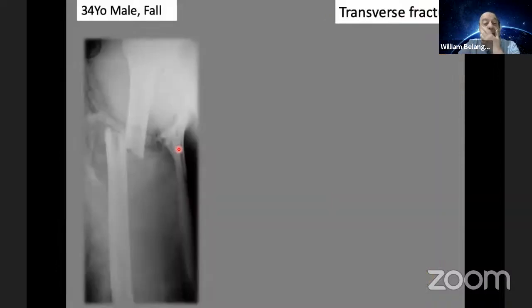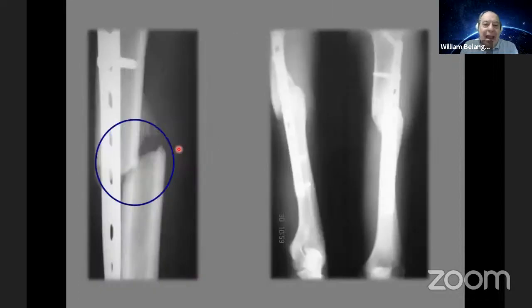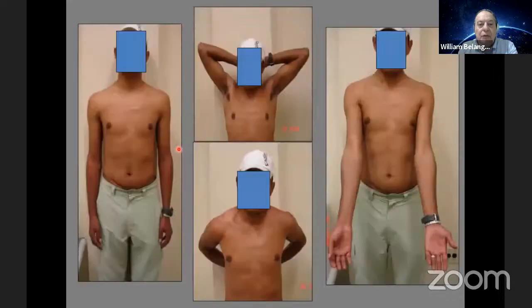Another case. This is a more proximal transverse fracture. In this case, you see the fracture was not well reduced, but you see both screws in divergent ways, and we got bone contact between the main fragments. This is the key. You see callus evolution and a good clinical result.